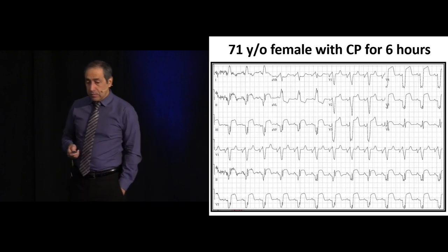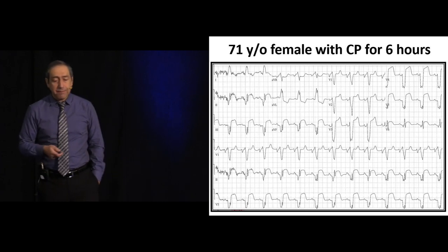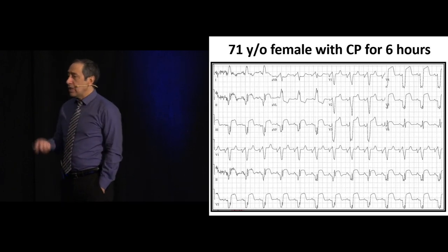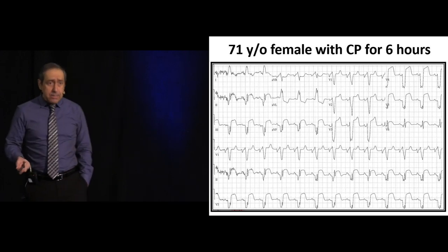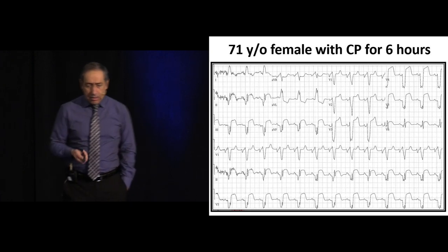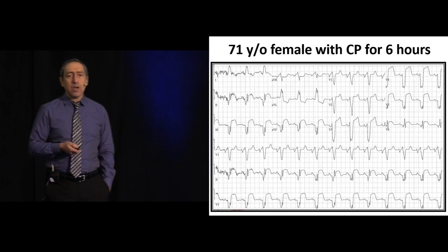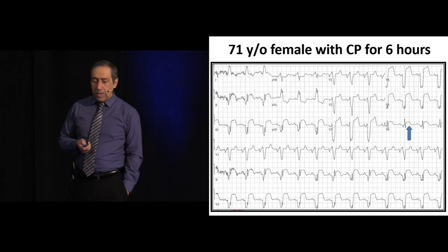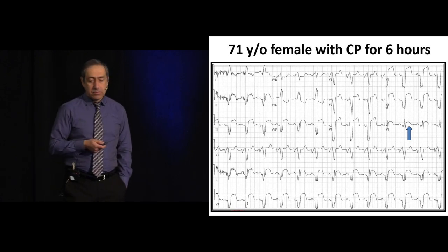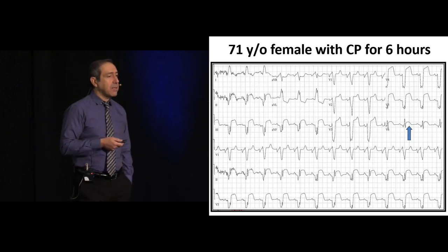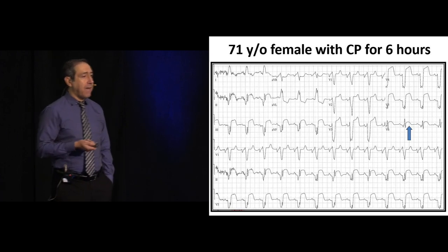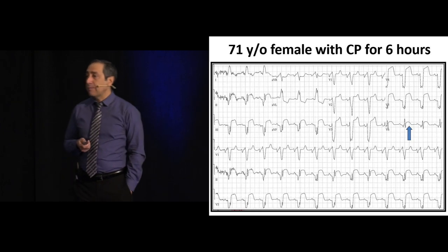Now let's look at this EKG example with left bundle branch block. Do you think this is a normal left bundle, or is there a hint of MI? How high are the ST segments? Pretty big — something like five or so. But is there concordance in any lead? Look here: is the QRS up or down? The QRS is up. Where should the ST segment normally be? Down. But here it's up — that is not usual. This patient is actually more likely having anterolateral MI rather than a typical left bundle branch block pattern.